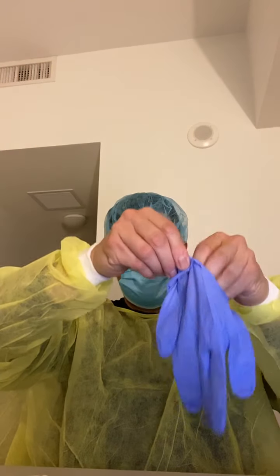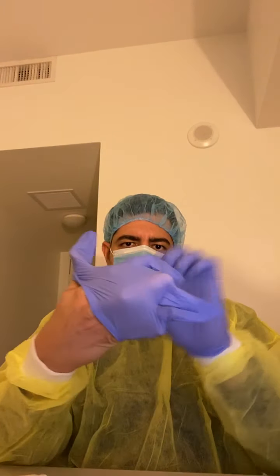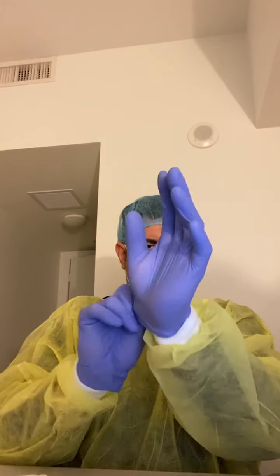So what we're going to do right now is don sterile gloves. We can always grab them from the border and put them on. Just grab from the border. This one is already sterile, so it's easier if we need to fix it. This is the dominant hand, and we're going to open the kit with it.